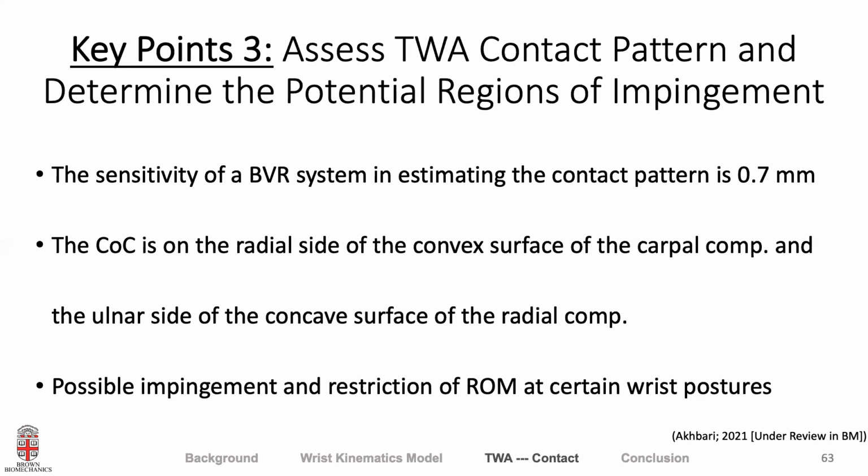So our finding can inform future design considerations for total wrist arthroplasty. It can also help us to determine protocols for wear and stress testing of the total wrist arthroplasty in the laboratory.